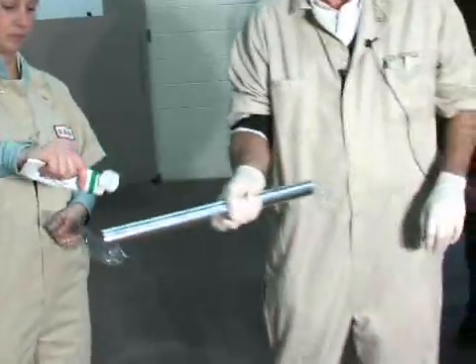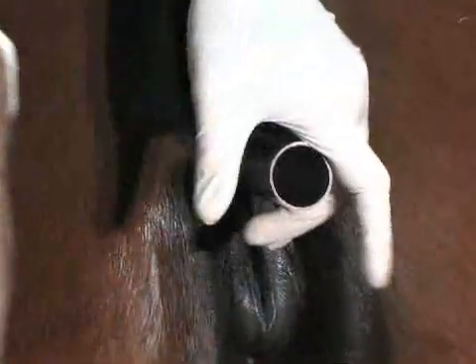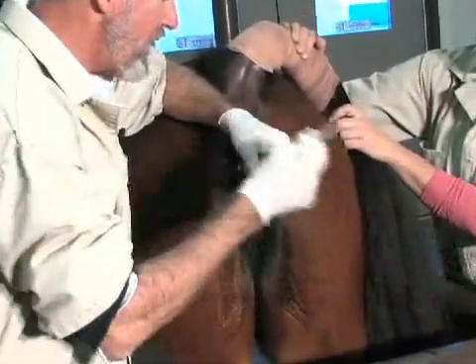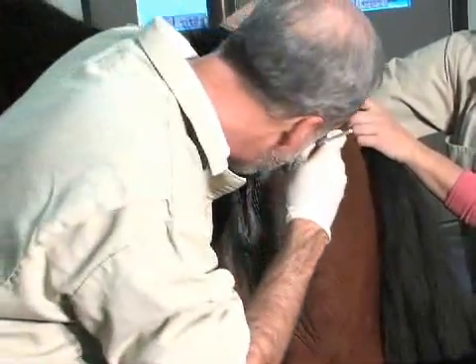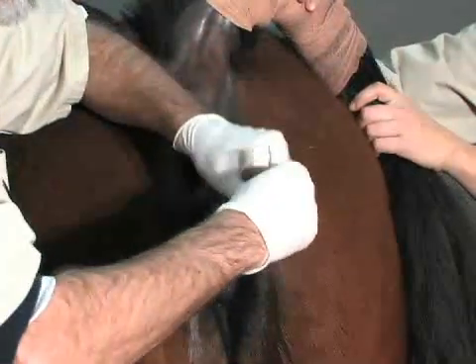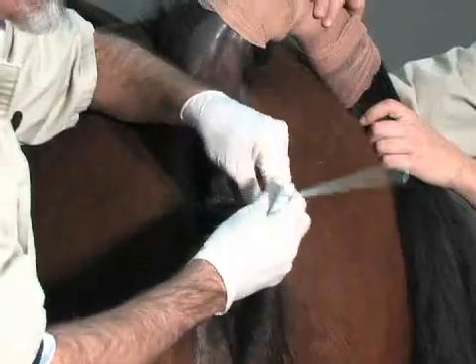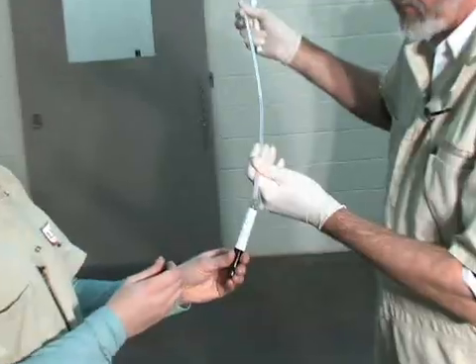Pass a vaginal speculum. The cervix needs to be somewhat relaxed because you need to pass a swab through the cervix into the endometrium. Again, we'll inoculate the Ames media.